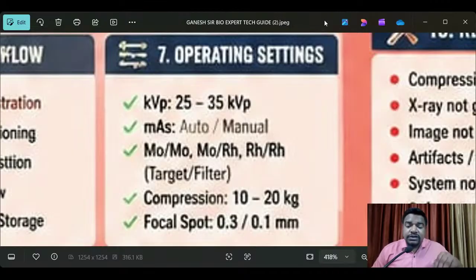But whenever there are new engineers and new technicians who join, they may not have an idea. Even if they have an idea, even if they are senior, as a biomedical engineer on a weekly basis we have to enter the department and check all things, including power supplies, at preventive maintenance time also, because any problem can come. It is electrical, electronic medical equipment, and electrical fluctuations may sometimes come, right? I hope you got it very clear what I'm saying here.